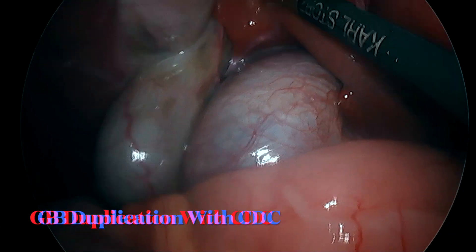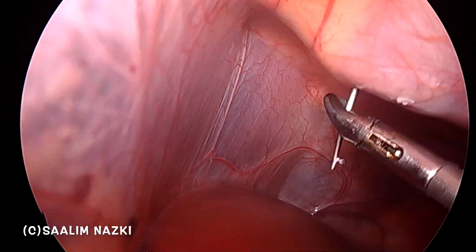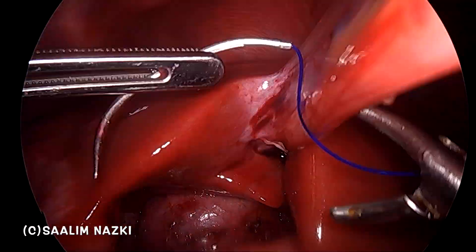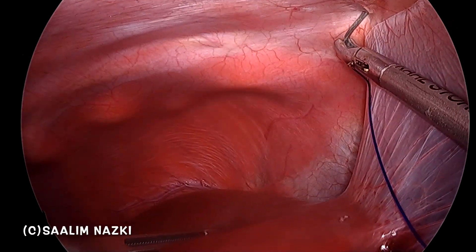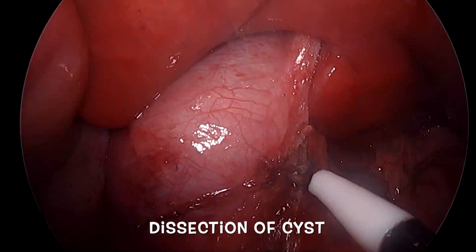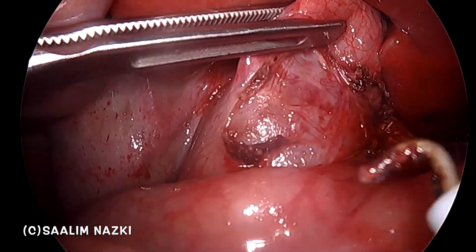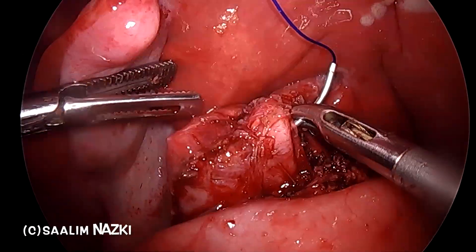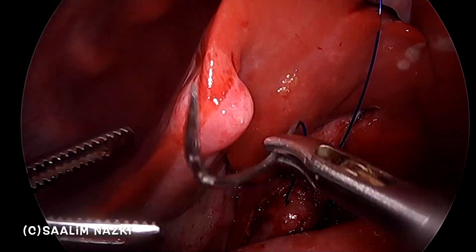On entering the abdomen, we had a surgical surprise of a duplicated gallbladder. We started with the hitch stitch that helped us retract the liver — a hitch stitch with the falciform ligament, as you can see very clearly using the prolene stitch. It would help you avoid an extra port. Next, we proceeded with the dissection of the cyst to take away the tissue surrounding it. Here I have taken one more hitch stitch on the cyst itself, which helps me retract or pull up the cyst so that I can do a proper dissection distally.